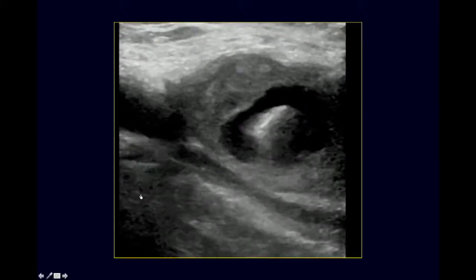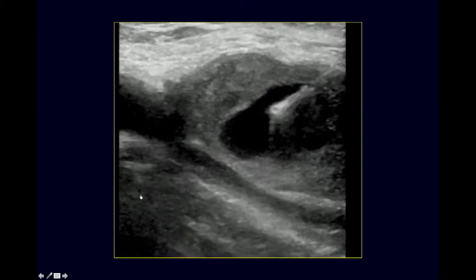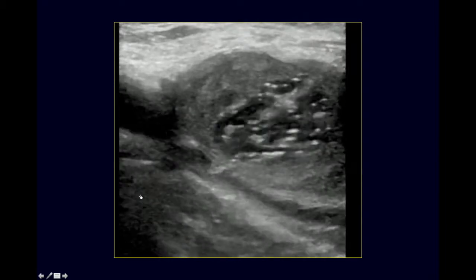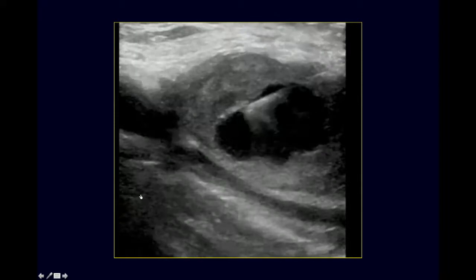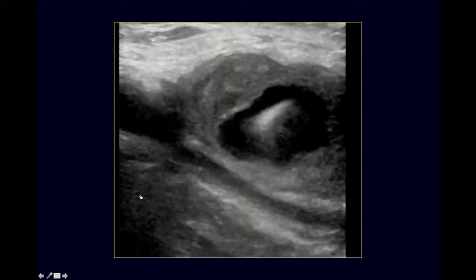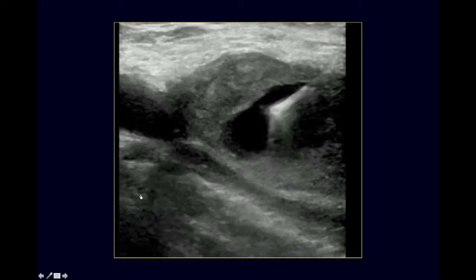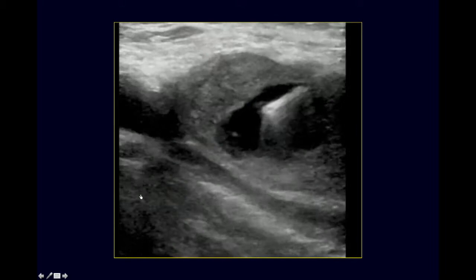You can see the needle tip very well. It's kind of pointing toward the area of the neck, but it's not in the neck. But watch what happens when it's injected. It goes directly into the artery. Okay? Which is exactly the thing that we want to avoid. And for dramatic effect, I'll let you watch it again because hopefully you'll never see this again. This is the thing you want to avoid.